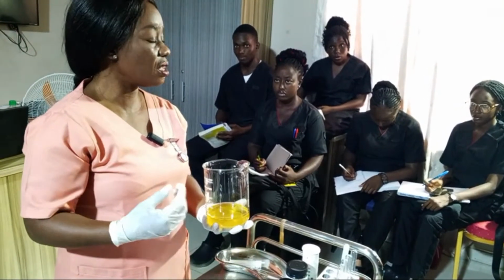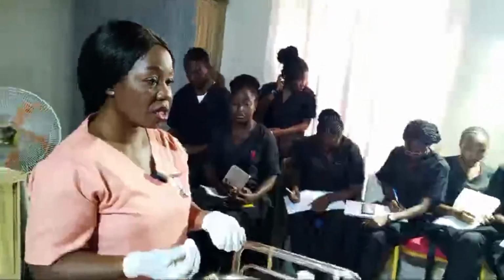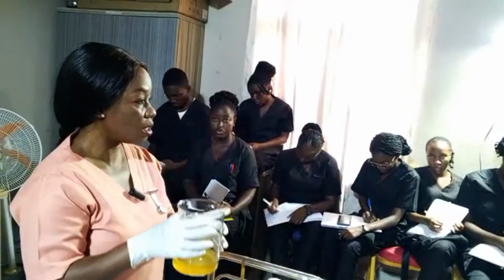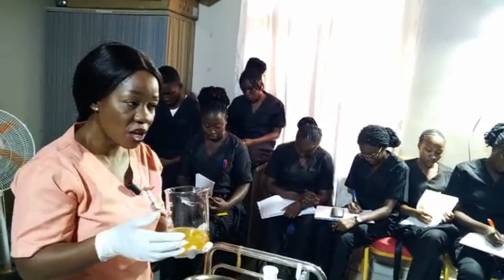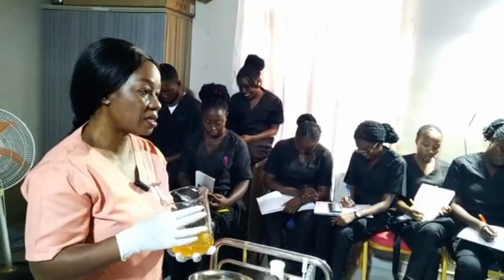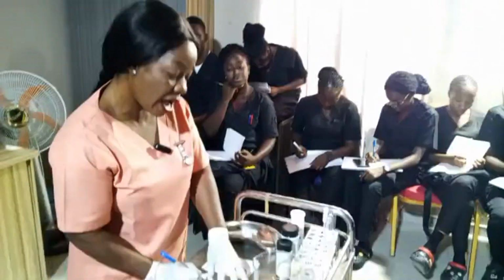You know, if somebody is diabetic, the odor of this urine will be what? Sweet. It will have a sweet smell. And the normal odor for urine is aromatic, right? Characteristic smell. So it is aromatic. So you carry the urine close to your nose and just perceive it, right? So I have seen, and then I will write aromatic, right?